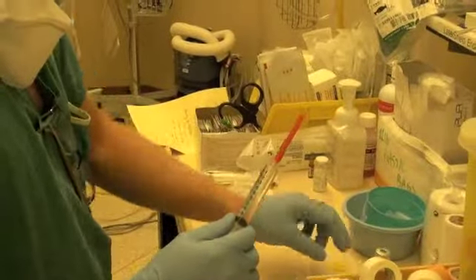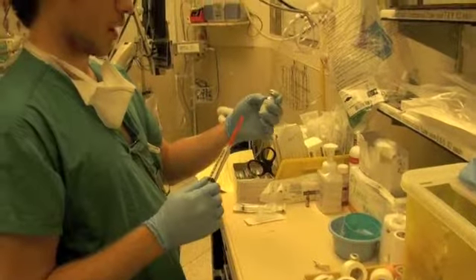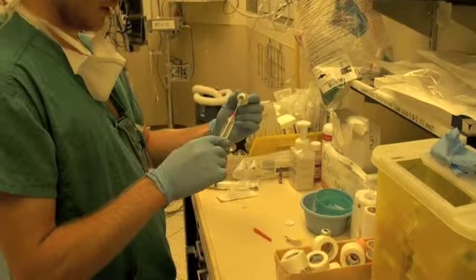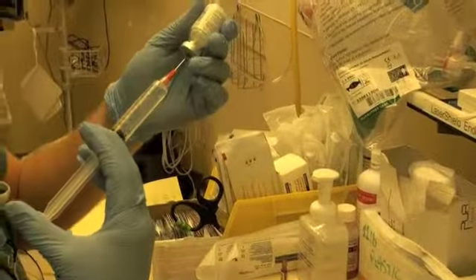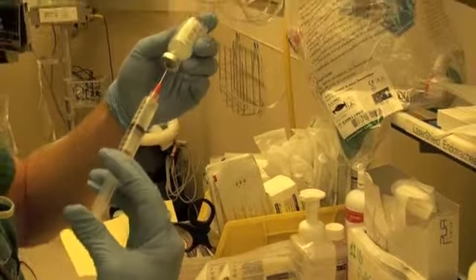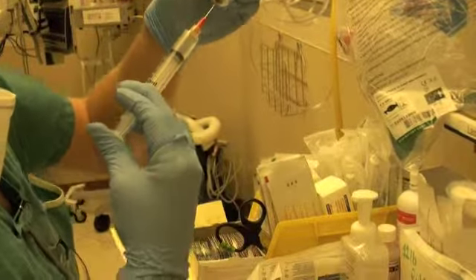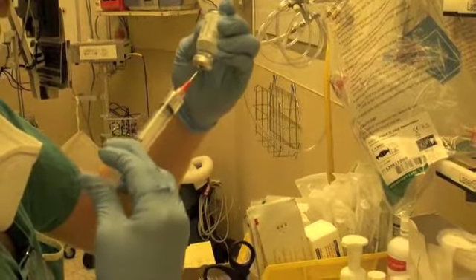But in this case, we're going to use this normal saline and demonstrate dissolving the 1 gram of cefazolin here. So we can pop the cap off of the vial, pop the cap off the needle, and we'll use the needle again, injecting it into the vial, and you can use whatever technique you want to dissolve all the powder, but make sure it gets nice and mixed around, and you can see for yourself if it's dissolving or not. And aim your squirts at any bits of undissolved powder.